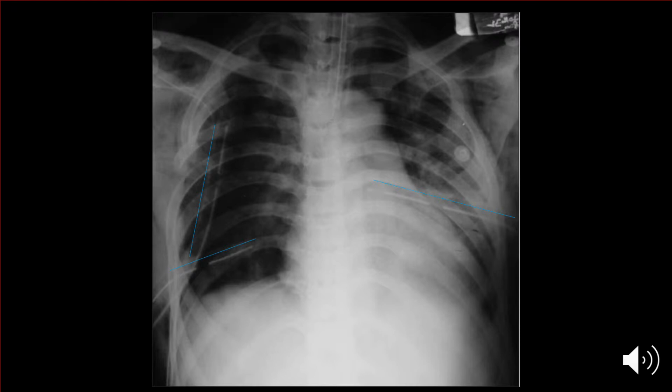But do you know what that white line is called? Yeah, we call it the radio-opaque line because it's opaque on radiography. But is it broken? Right there. You see what I'm talking about? Look closer, and, oh dude, we put 3 defective chest tubes in? Is that what happened?